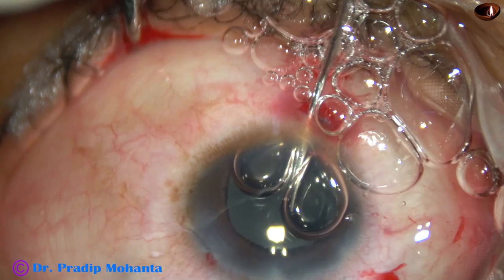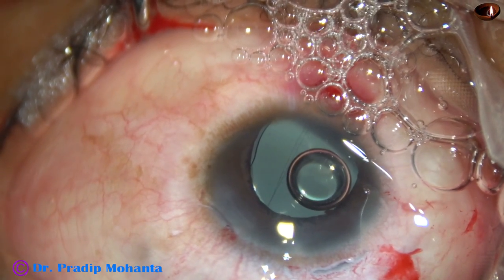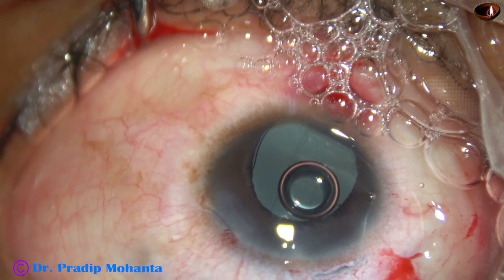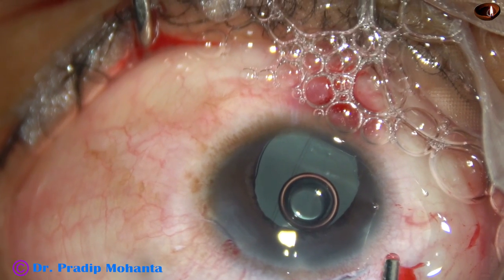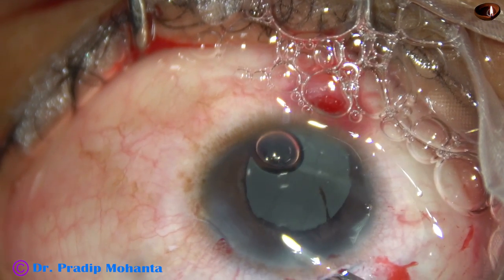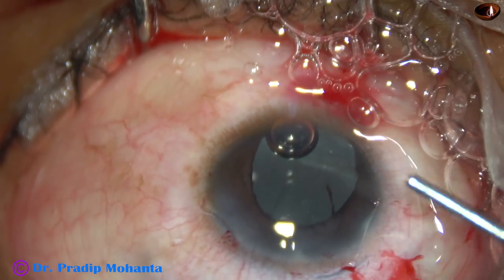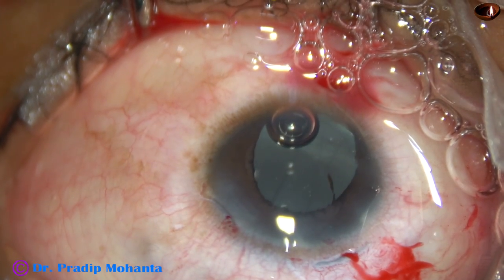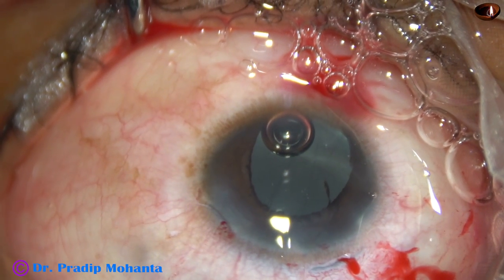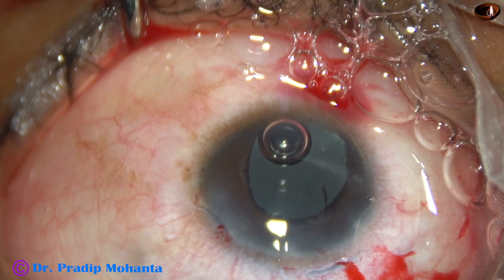My plan is to do a sphincterotomy at 1 o'clock, just opposite the 7 o'clock incision. This is the reason I made another side port at 7 o'clock. The pupil is getting constricted so I inject a little visco. Now to introduce a Vannas scissors through the 7 o'clock wound, I am going to enlarge it a little bit so that I can introduce the Vannas scissors and cut the pupillary margin at 1 o'clock.